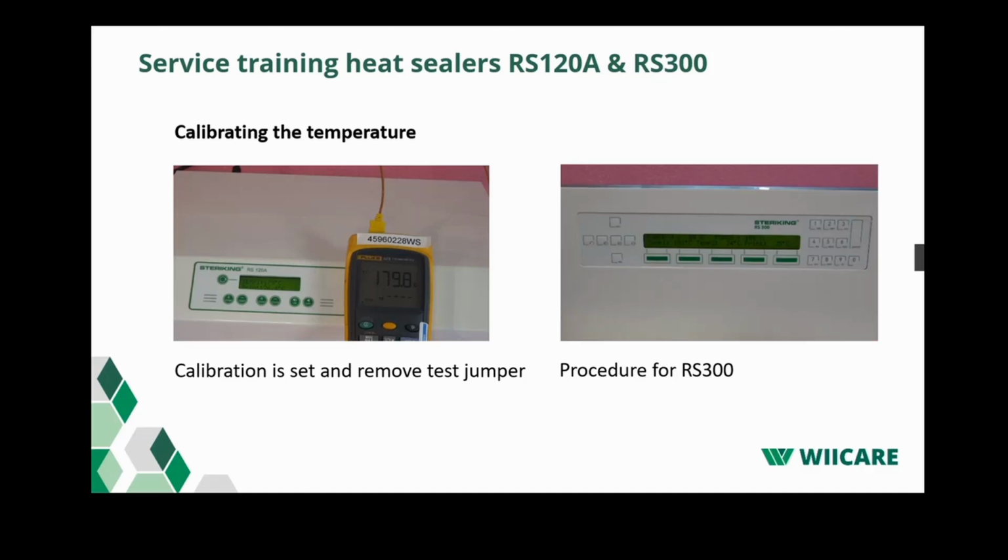To adjust the base value of the force cell, use push buttons 7 and 9. With 7 you decrease the value, and with 9 you increase the value.